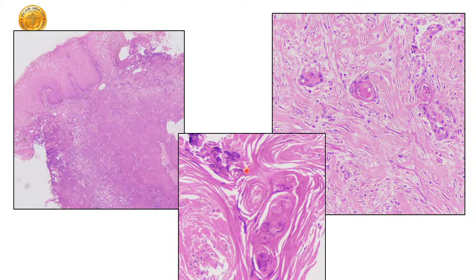So we received TURBT for this. Images are pixelating, but when we receive the TURBT, you can see that there is squamous metaplasia of the overlying urothelium, going much deeper into the lamina propria, gone beyond the lamina propria. This was the deep muscle in the TURBT, that is the transurethral resection of the bladder tumor. We can see some squamousness going deep into the muscularis propria. We can see a lot of keratinization, some keratin pearls here. So this actually turned out to be high-grade urothelial cancer with squamous metaplasia and extensive squamous differentiation.